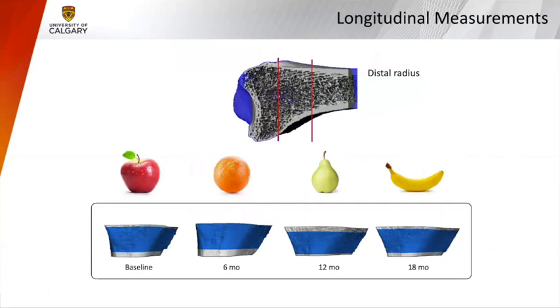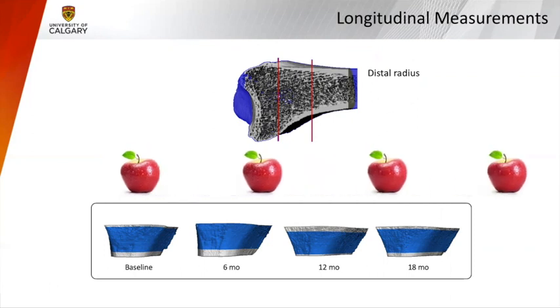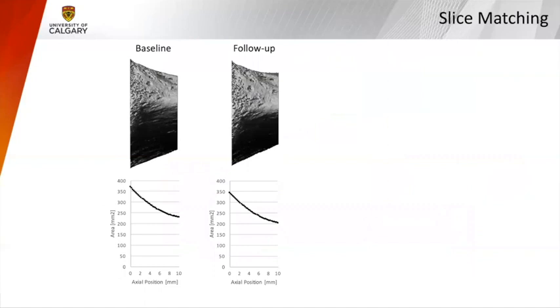Otherwise, when you scan somebody, for example, 4 times, you're not comparing the exact same regions, and so there's some noise in your data. If you do the 3D registration, then ideally you're comparing apples to apples, so you get a really good measure of reproducibility. The downside, I guess, is you do lose a bit of the scan region, but ultimately you should be able to keep at least 90% of the scan region and still get very good results.